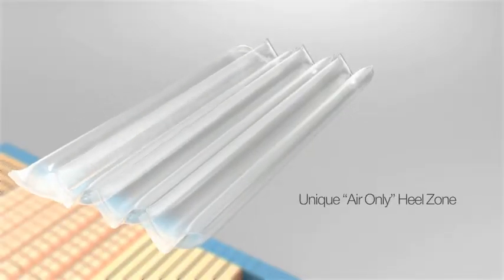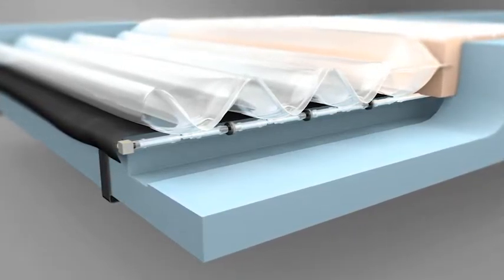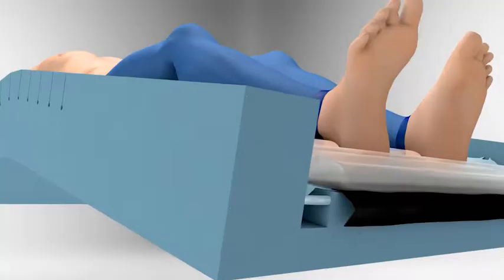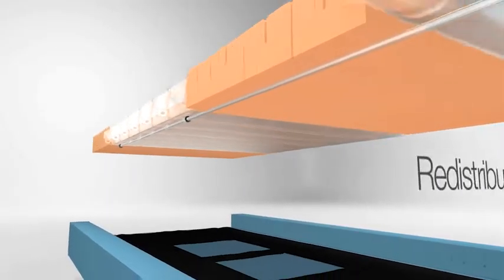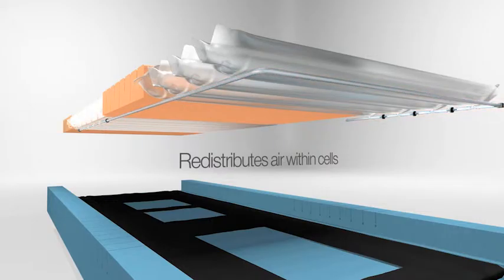The unique air-only heel zone floats the heels, offloading pressure and minimising the need for costly and complex equipment add-ons. The heel flotation zone helps minimise the risk of pressure damage, especially when the bed is profiled, which naturally increases the pressure on this most vulnerable area. The heel zone utilises air displacement technology, redistributing air within the cells in response to patient weight and movement for the most effective pressure care.